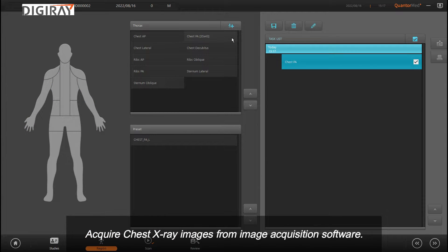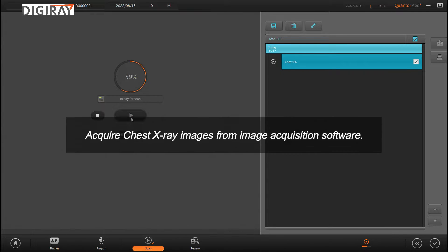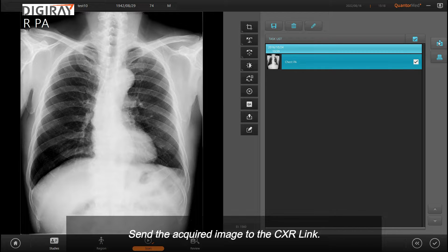Acquire chest X-ray images from image acquisition software, then send the acquired image to the CXR link.